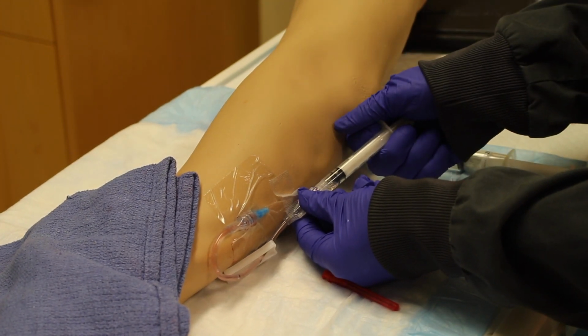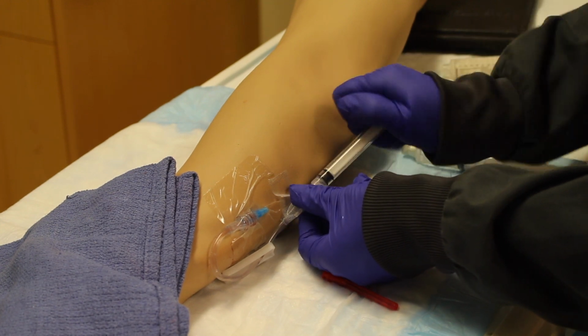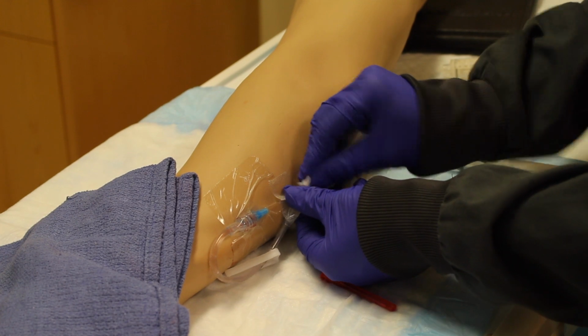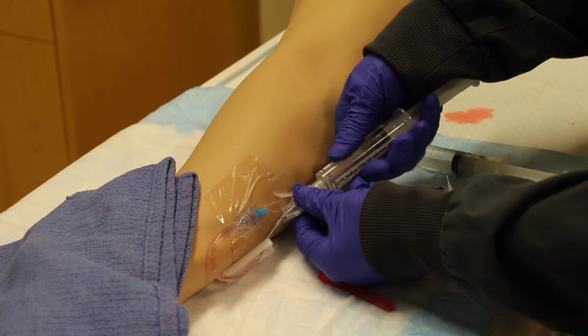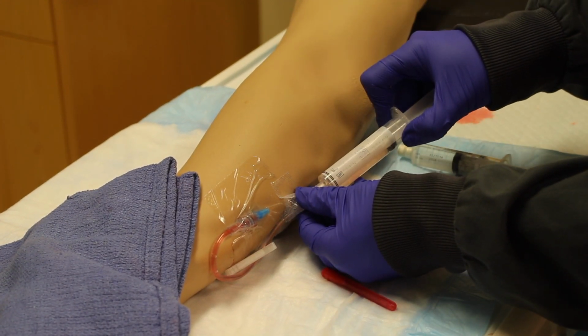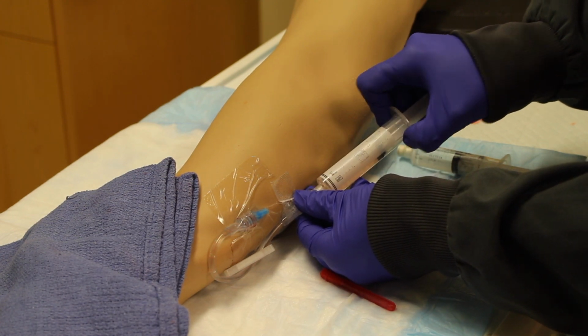Disconnect the medication syringe. Scrub the injection port and reattach a new IV flush. Once attached, inject the flush at the same rate as you were supposed to for the medication. This is because there is medication still in that extension tubing, so if you were to give this flush too fast, you would then give the rest of the medication too fast.